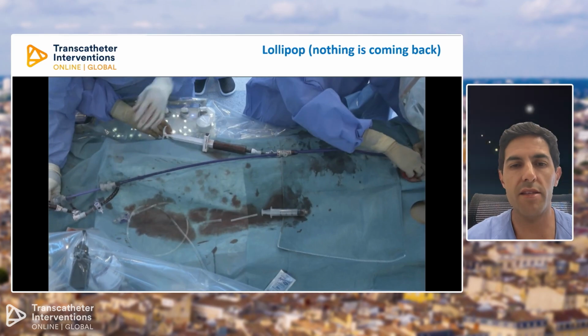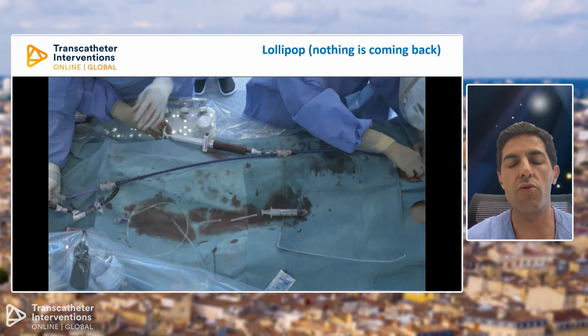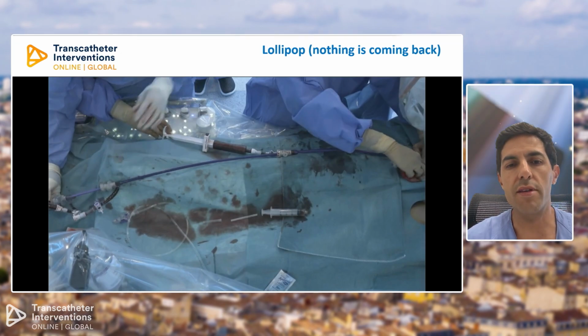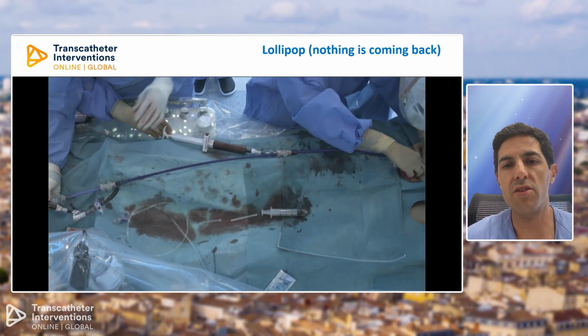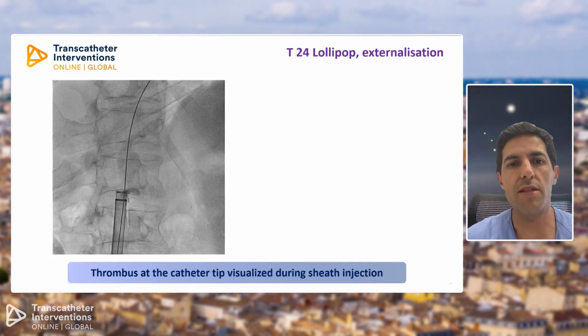And maybe if you don't do this properly, or if you are a little bit unlucky, you might re-embolize this thrombi, and this is a risk that pertains to this procedure, and we all need to know this and be aware that we might be having a brisk deterioration of the patient if re-embolization happens, which is very much not frequently found, but we must know that this might happen.